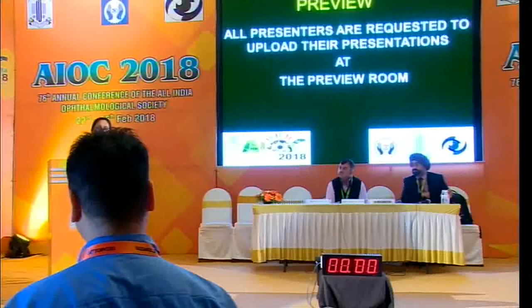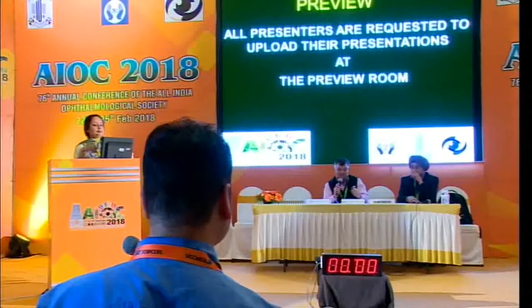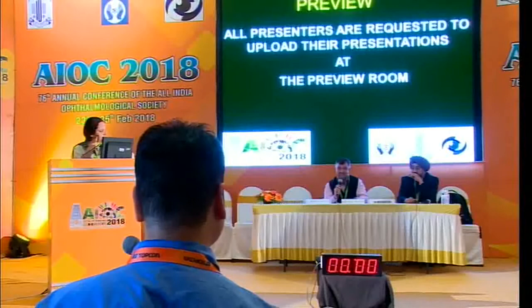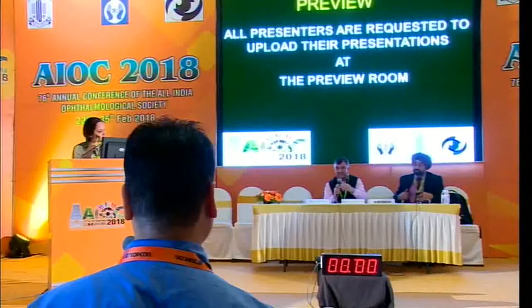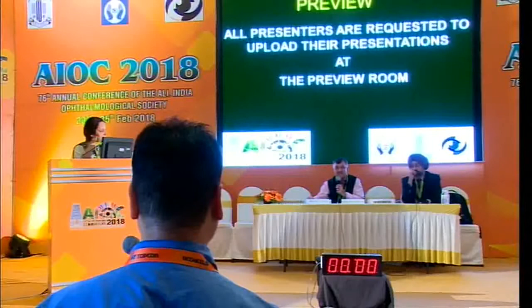One of the things which you should always do, at least I did for a long time, diabetic vitrectomy is a different ball game, even when we never had anti-VEGFs to give pre-op. Whatever cleared area you have, keep on lasering that area. Don't wait till the end. This is something which I followed. If you keep on doing that, then even if you have such an eventuality, you are absolutely safe. But most of the time, we are waiting till the end, and by that time the blood is oozing from many places and you have an issue.